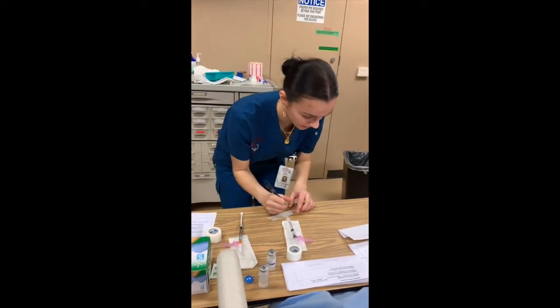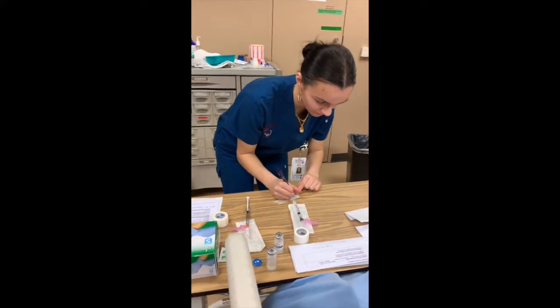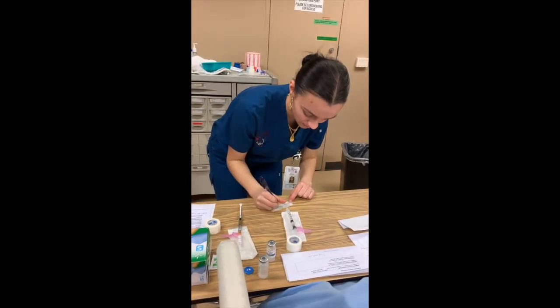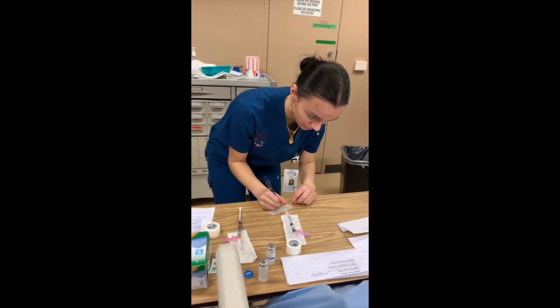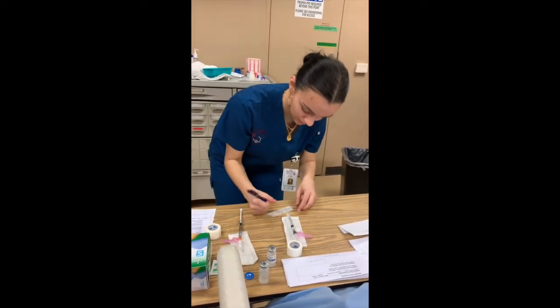I'm going to be writing the actual drug name, so that is going to be the haloperidol. And this one is going to be given intramuscular. So I'm just going to write that down for identification. And then I'm just going to be writing the dose, which is the 0.5 milliliters per 1 milligram, sorry.